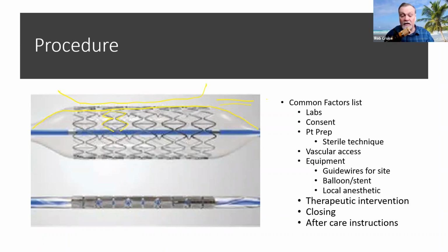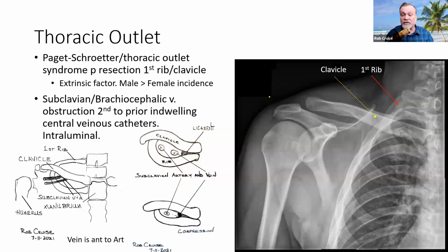And last but not least, make sure that the patient knows what to do next, right? Aftercare instructions are important. Because they just went through a procedure, they might or might not remember what you tell them verbally. So make sure you put that into the chart so that they have a record of what they can and cannot do when they are feeling back like normal, right? So those are the things that we need to do for every procedure.